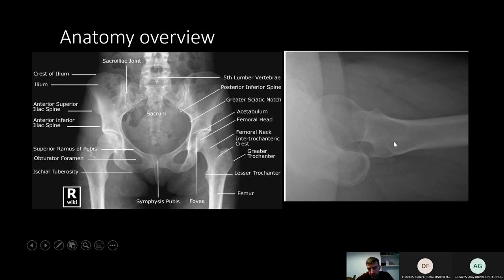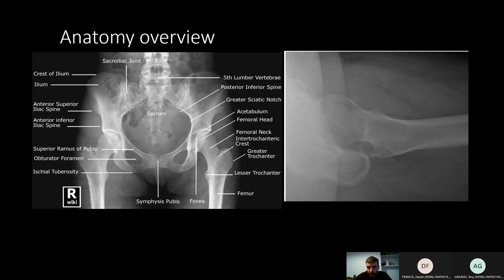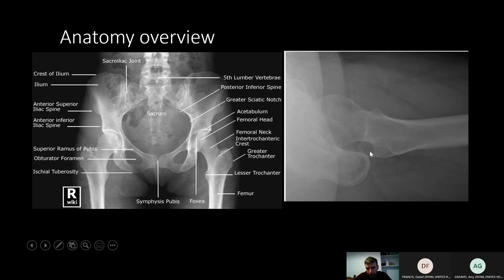This is the lateral view — more of an oblique view really — which is always a bit intimidating and often quite difficult to interpret, but it's very useful. When trying to work out what's anterior and posterior, remember your ischial tuberosity is always going to be at the back, so that tells you the anterior, and then you've got your trochanters, femoral shaft, and femoral head.